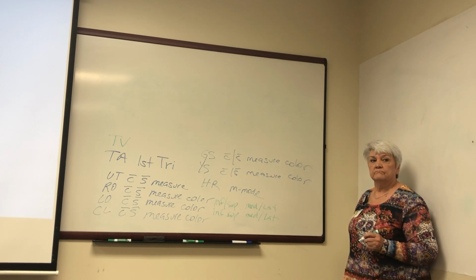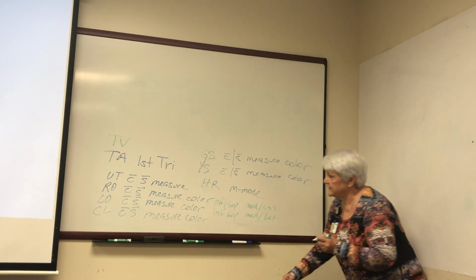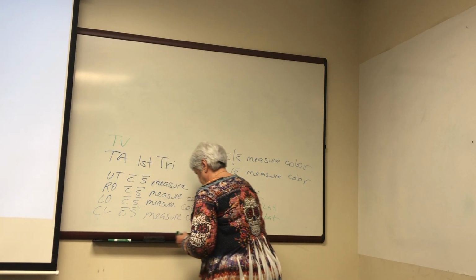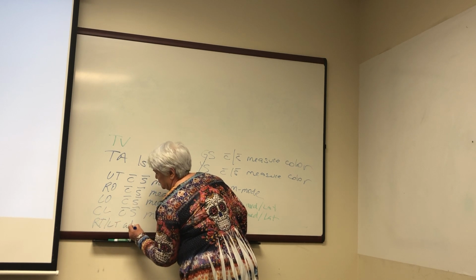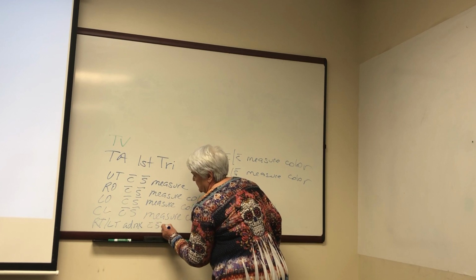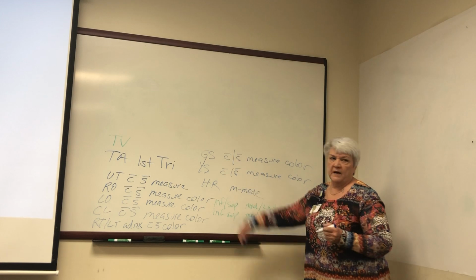What if sometimes we cannot find both ovaries? Adnexa. Just put adnexa. Okay? Oh, I forgot that, didn't I? Okay. You'll do right and left adnexa.